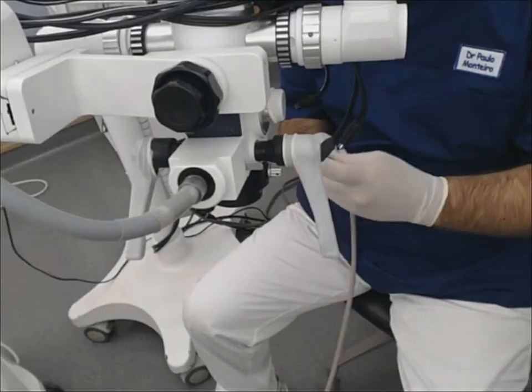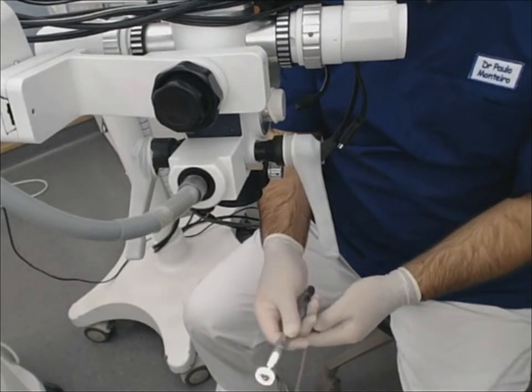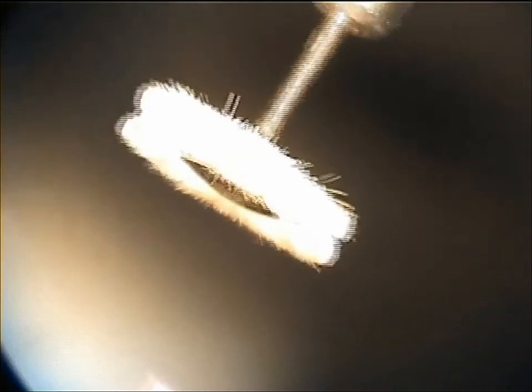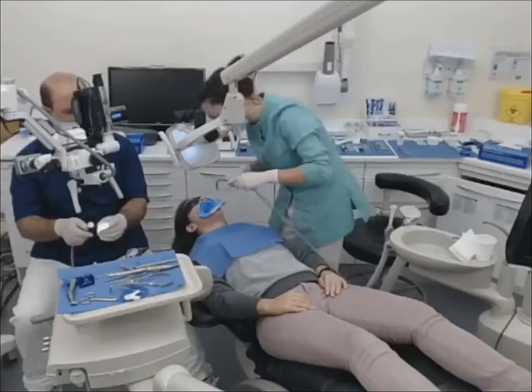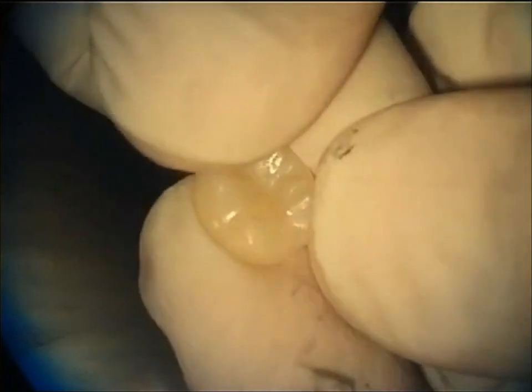Okay, so for finishing, I'm just gonna use this wheel. Okay, it has a chamois in the middle, so it gives a very high shine. Surface. Okay, so you can see the brightness of the surface. Okay, so it's very easy, so it's done.